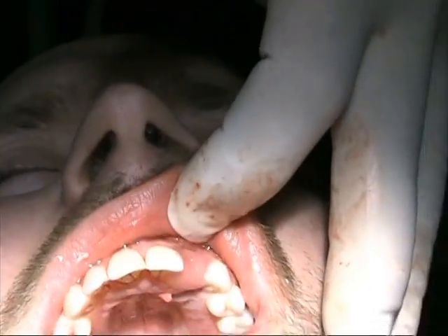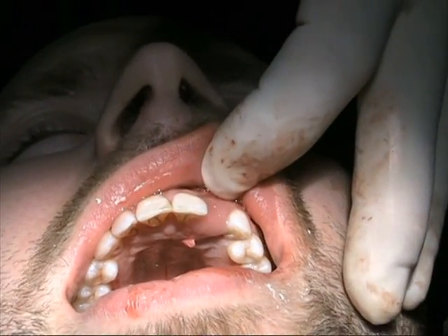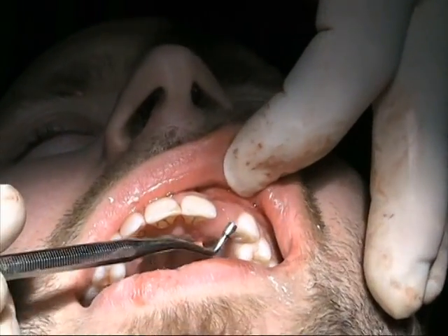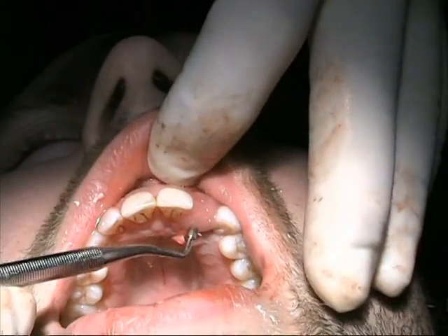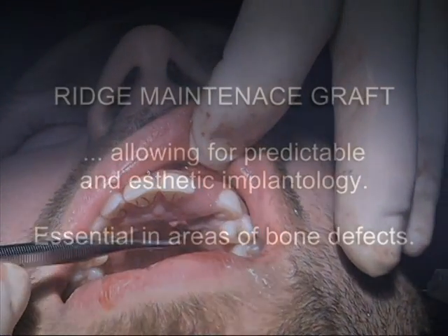We're going to take a look at this post-operatively in a couple of days and next week as well. I like to follow these up quite carefully. So that's it for our ridge maintenance graft procedure.